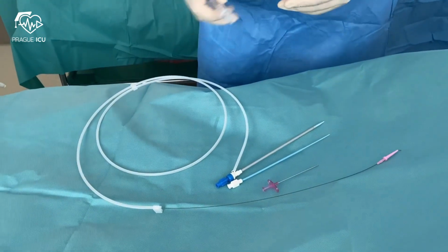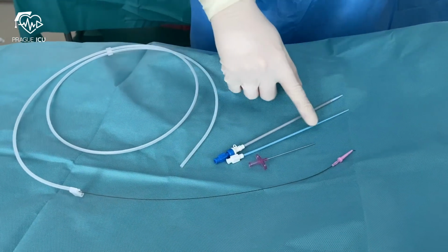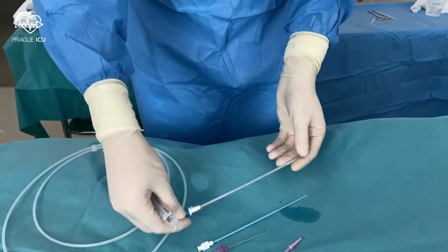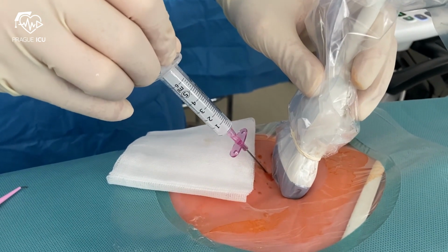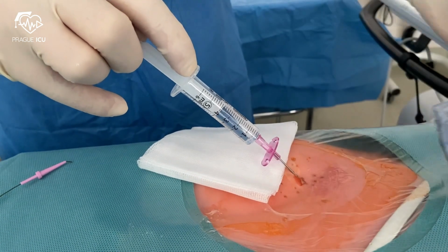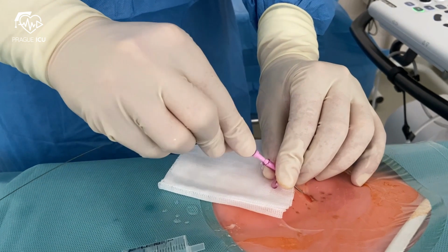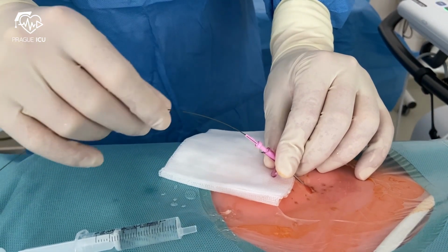Before starting the procedure, have everything prepared by side: guide wire, needle, dilator, and sheath. Access the femoral artery at 45 degrees with a needle under ultrasound. Pass the guide wire through the needle and advance until the tip is in the thoracic aorta. Wire should pass very easily.